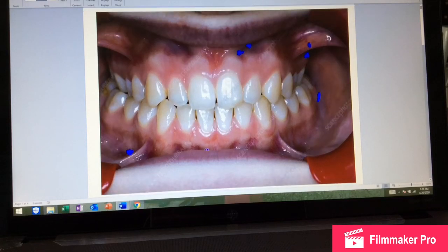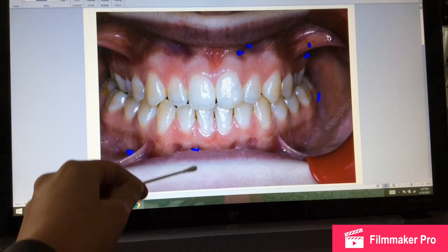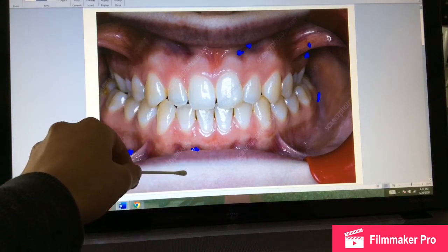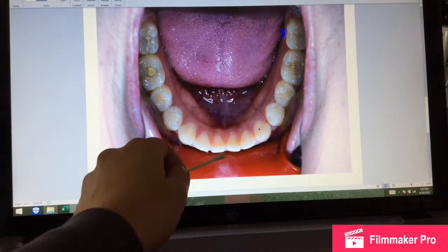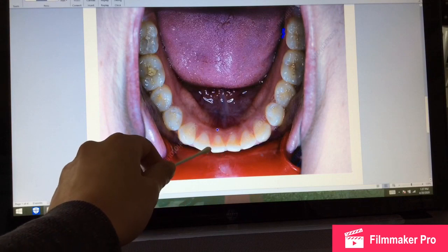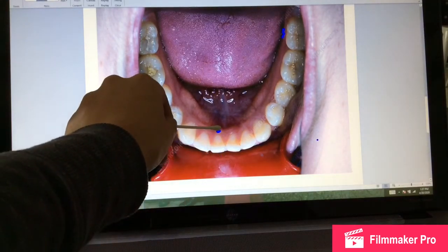And we also need to do an infiltration for that tooth as well, and it's going to be around here, right here, around this, for that tooth. And we also need to do a lingual block there. So if you go down to our lingual side, tooth number 25 is here. That's one of our central incisors, and then we're going to do a lingual injection for that tooth.